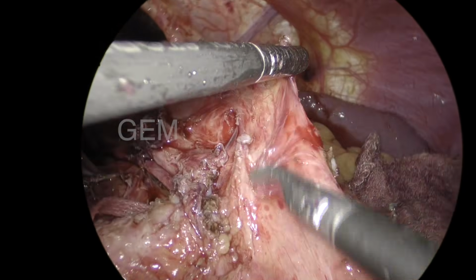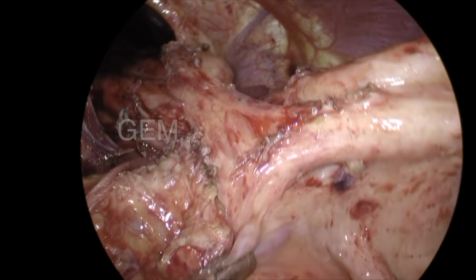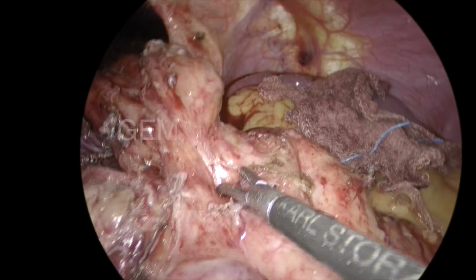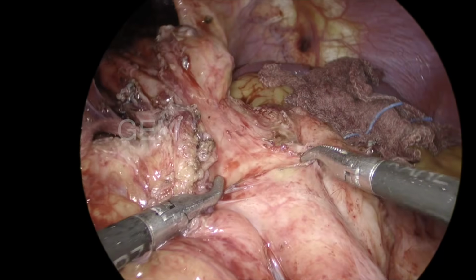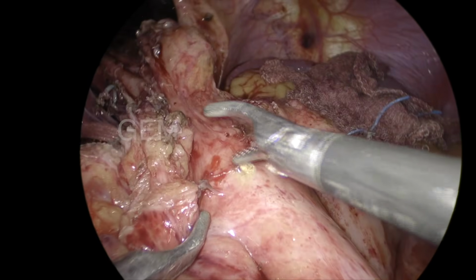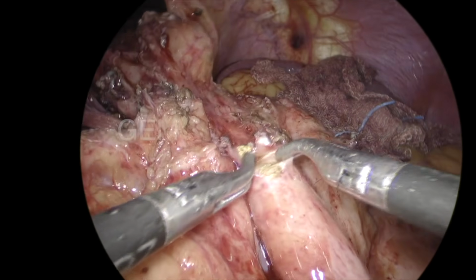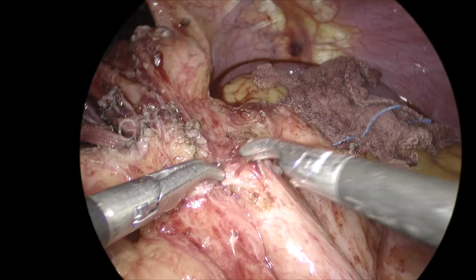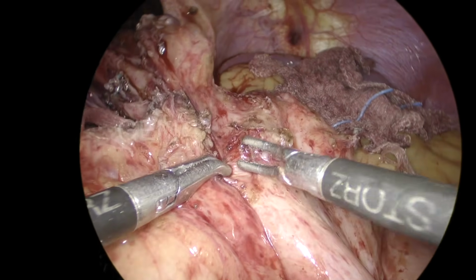I used to start myotomy just 1 or 2 centimeter above the level of the OG junction. In this case, the myotomy is already done in the esophagus, it is very clearly seen. So, I tried to start the myotomy at the OG junction level. Just marking up to what level I have to come, marking with the cautery. And usually I do perioperative endoscopy in all redo cases. There has not been any injury.